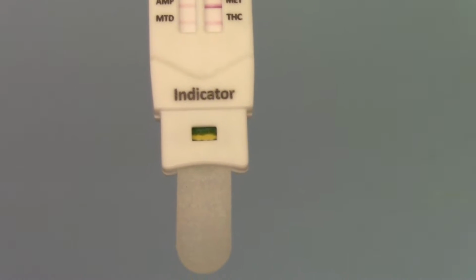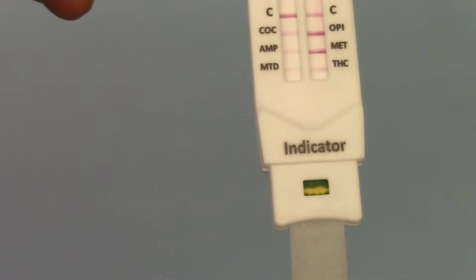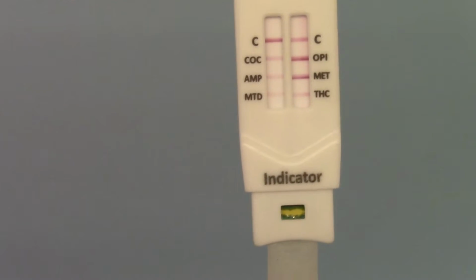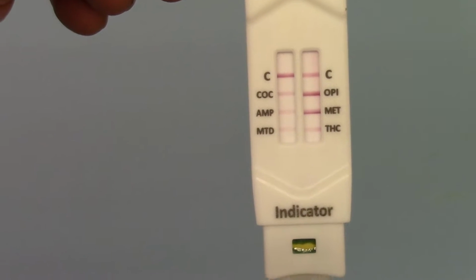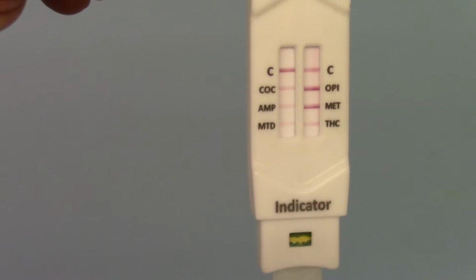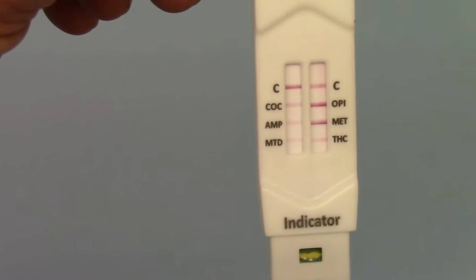But as you're getting the blue coloration increasingly come over that yellow indicator for the saliva, once you've got the control lines run, you can remove it from the oral cavity and put the cover back on. Now if we just run you through the results here, you'll see this is whitening up. We're approaching the read time of between 5 and 10 minutes.